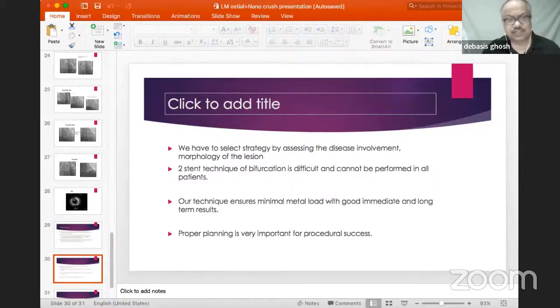So 4.5 is right. There are some stent platforms which claim that they can go up to 1.5 times the nominal diameter. And there are certain stent platforms, if you remember, where the 3 and the 3.5 are the same. It's only the balloons which are different. I will not go into the commercial naming of the stents. I'm sure we can get that information. There are certain stent platforms where the stent of a 3 and a 3.5 is no different. It's only the balloon which is different. The other thing, there are some stent platforms which give us at least a leeway of 1.5 millimeter expansion beyond what has been labeled, say 3 will go up to 4.5. So I would be more comfortable planning that ahead.